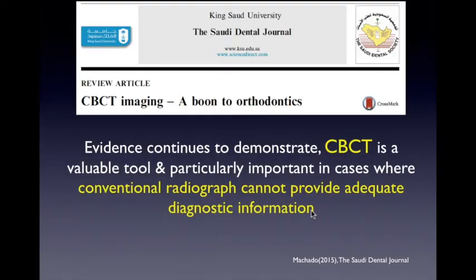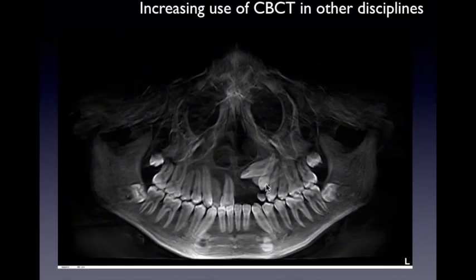So I've shown a lot of applications in terms of maxillofacial surgery, but CBCT has gone beyond just simply maxillofacial surgery. Orthodontics has used it not just to determine clearly landmarks, but in terms of planning, like one case that I had before of several impacted teeth, the ortho, together with me as we planned it, determined in CT scan which tooth could actually be forcibly erupted at the same time, like playing pickup sticks.